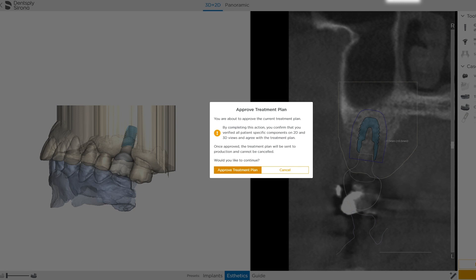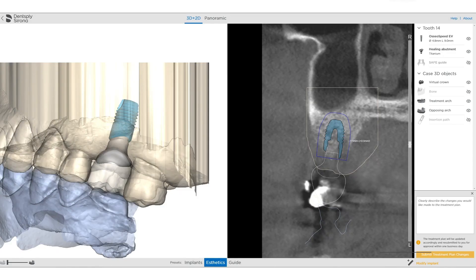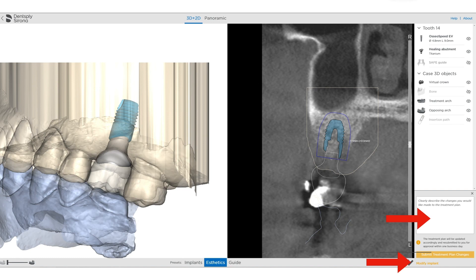If you decide you want to make a change, a comment box will open up and you'll be able to write specifically any changes you want. It might be the position of the implant, a different size implant, or anything about the restoration — such as changing the contour or margins of the abutment or any other restorative components. You can simply write in the comment box what you'd like changed.